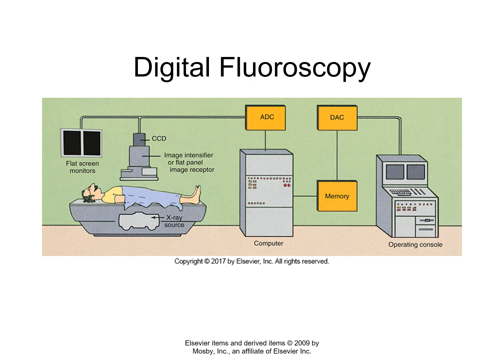All right, so our CCD, our first generation digital fluoroscopy, see how it says image intensifier and then the CCD stacked on top? That CCD is connected to the output phosphor via fiber optic cables, okay, or fiber optic wire, okay? So fiber optic wire is a polymer plastic that behaves funny with light. It's shaped like a cylinder, a flexible cylinder. If you put a light photon in the entrance face of that cylinder, the photon has total internal reflection. That means it doesn't come out the sides of the fiber optic cable. It's stuck inside the fiber optic cable till it gets to the other end of the cylinder. So fiber optic cable is a neat little way to bend light and steer it to exactly where you want to. It's like a hose for light, is what it is.